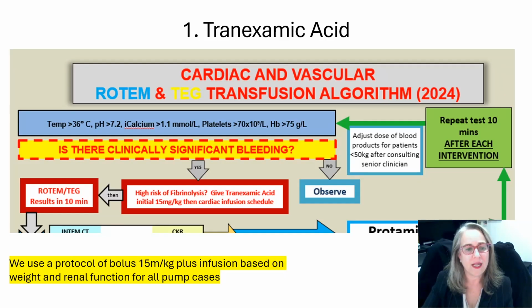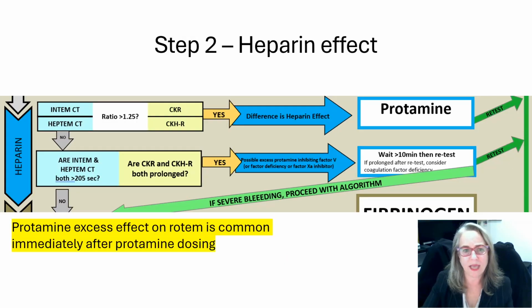So just to go over it in a little bit more detail, the tranexamic acid step, we use a protocol and it's based on weight, and that's for all pump cases. I think it's in the brochure that comes out of the box. It gives steady levels for all patients and respects renal impairment. And that's what it looks like, so that it's a bit closer and you can see it.